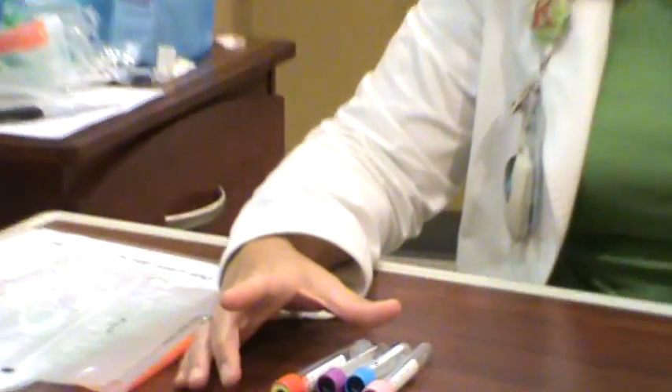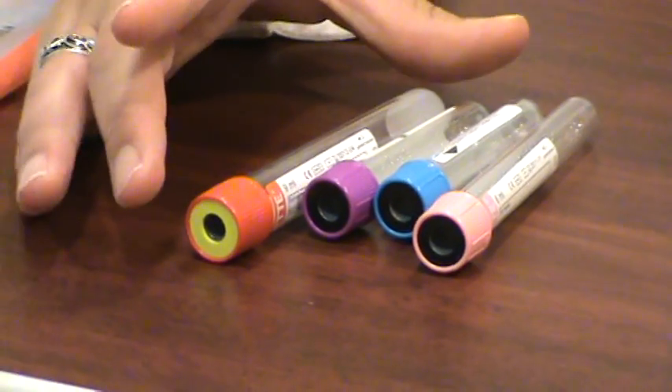Once you find your site, you want to cleanse it thoroughly with an alcohol prep, let it dry, and seat the vein. When you begin to draw with your tubes, there is an order of draw — this is important. If you draw one tube before another incorrectly, it can cause erroneous results.